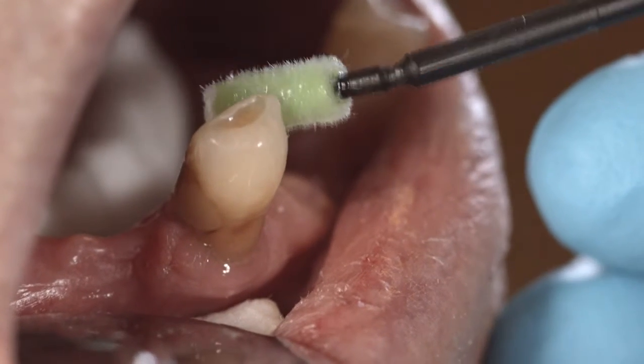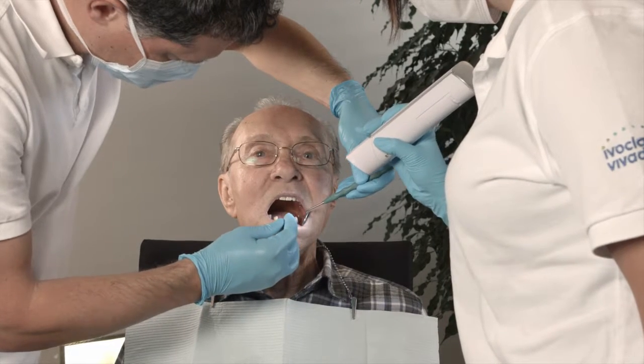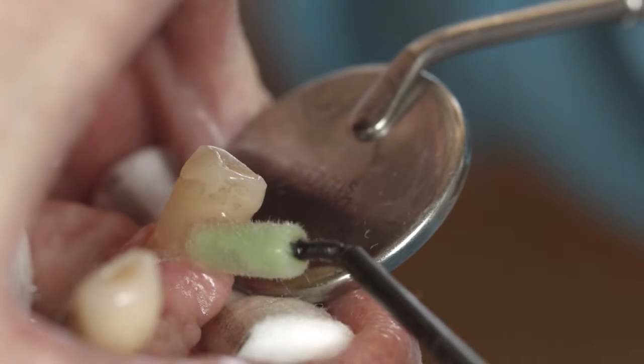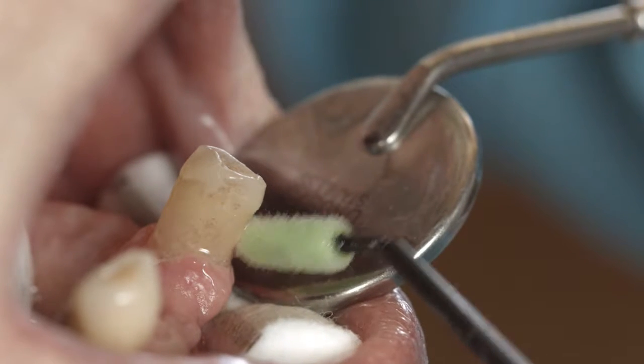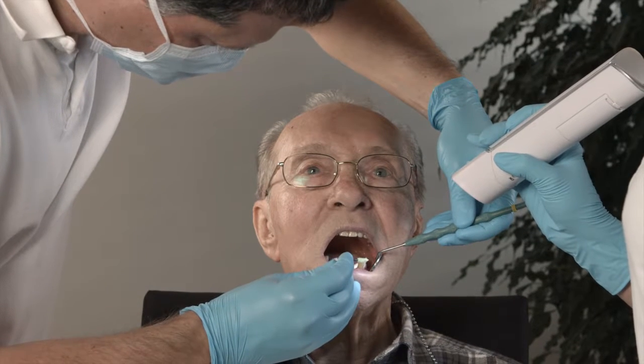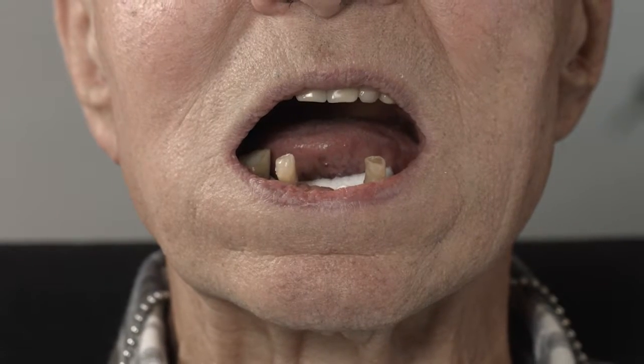The teeth are supplied with fluoride and the bacteria count is reduced. Apply the liquid varnish selectively to risk sites. From there, the varnish will flow directly into the complex surface structures. Susceptible areas such as those along the margins of crowns and bridges receive the required multiple protection. Let the varnish dry for one minute.